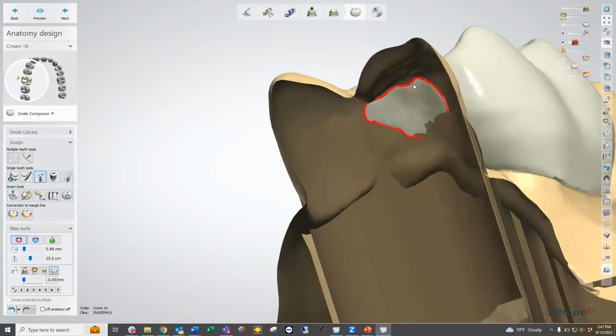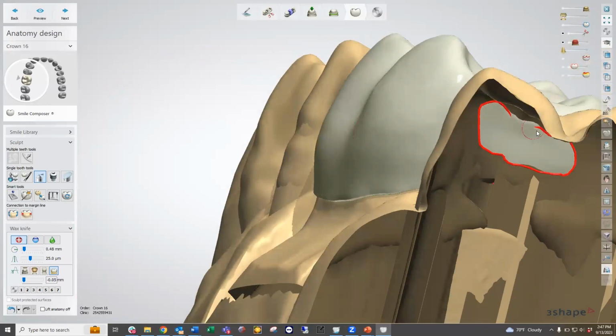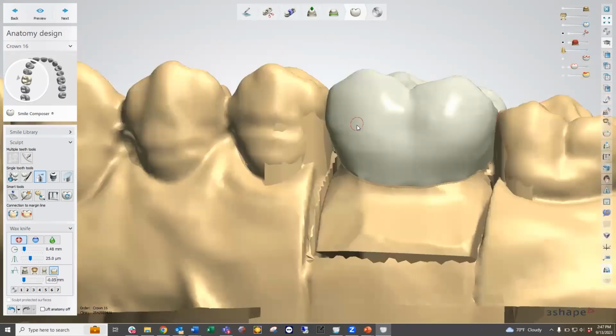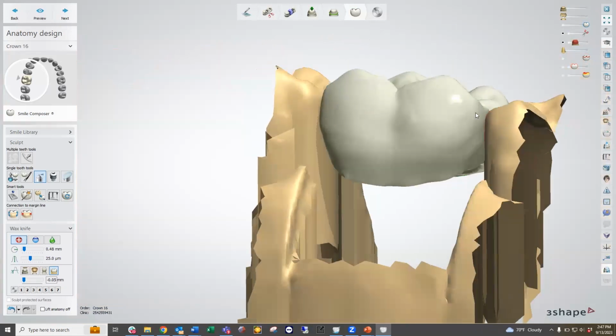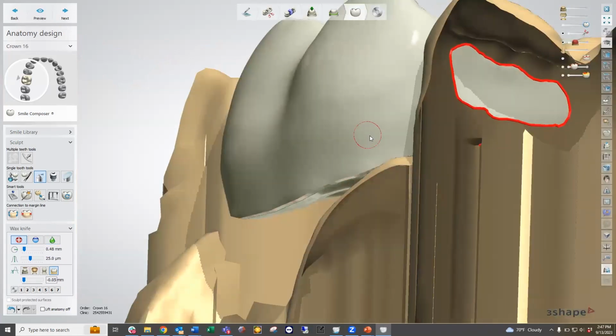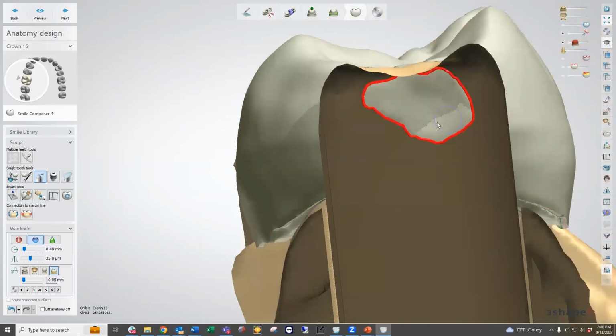Okay, and so I want to have a nice broad contact as far as the interproximal goes. I want this to have a nice broad contact, but noting that we're not actually going to have this contact being directly this broad, because it's just taking into consideration the path of insertion. So I'm just going to create it nice and broad right here, and then take away any areas that are overburdened in this area down again to that negative 0.05, which tends to be a nice number that we have for our interproximal contacts. So I'm going to go ahead and take away all that material.